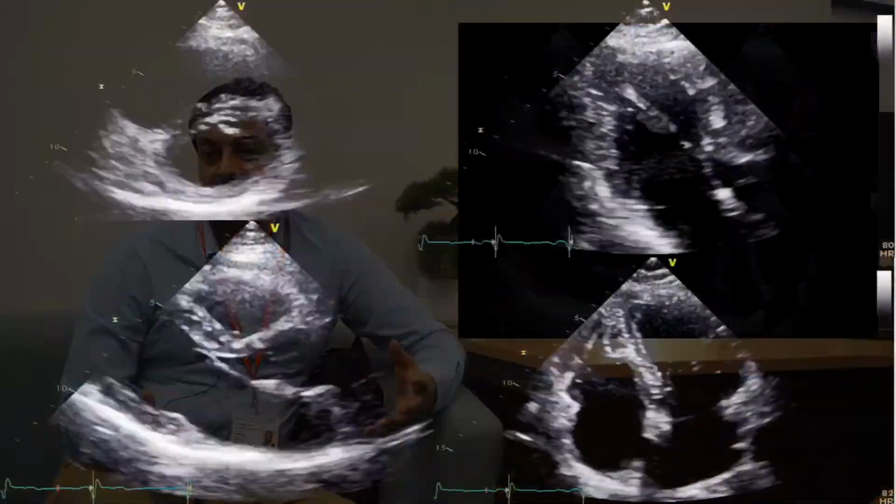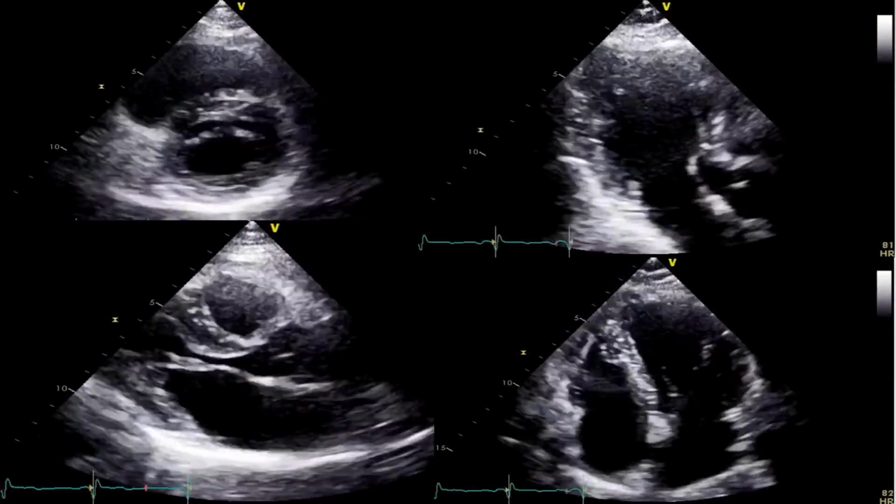And this is what we get. So I have deliberately picked a very real life case. This is not the best textbook case of echo that you'll see, but this is very typically what we actually get on the ward to look at when we have inpatients.